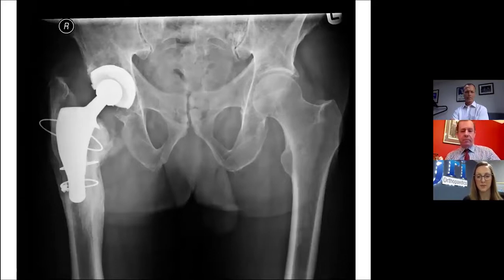That's really very impressive. Very impressive. Was that a brave thing to do? Some would say it was a stupid thing to do, but it worked well. It wasn't necessary to do anything more than that. It did the job. Johan, what do you think to that? No, I think the bone had reconstituted nicely proximally. So I think you can do that.